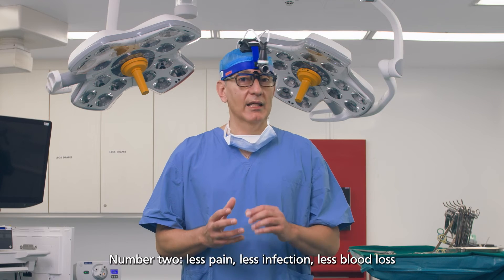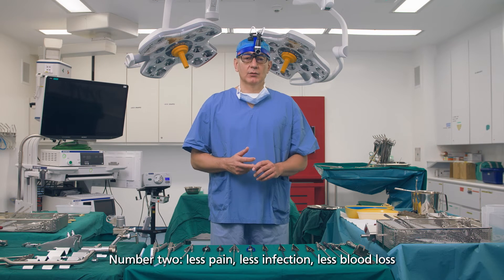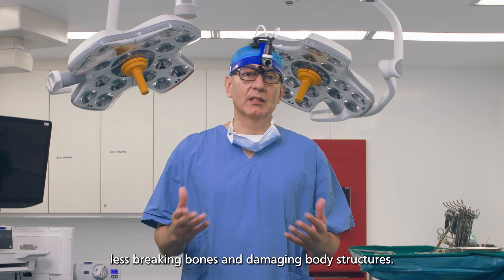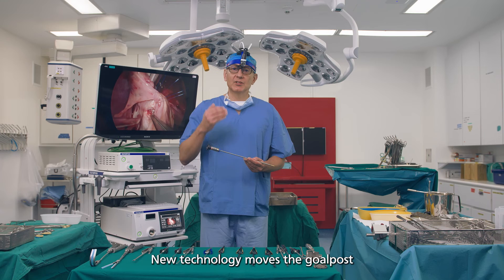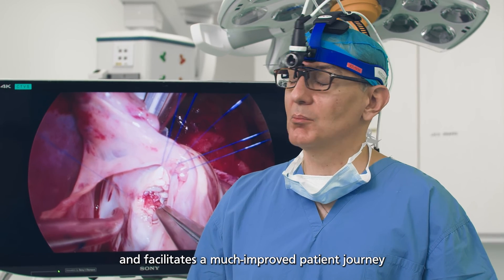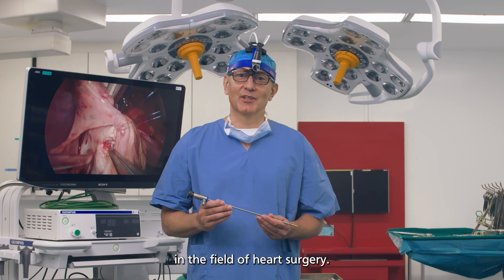Number two: less pain, less infection, less blood loss, less breaking bones and damaging body structures. New technology moves the goalposts and facilitates a much improved patient journey in the field of heart surgery.